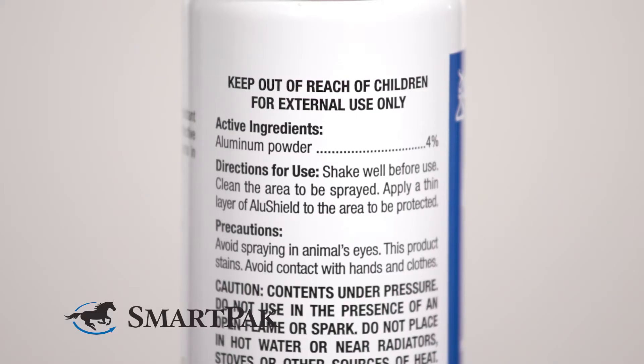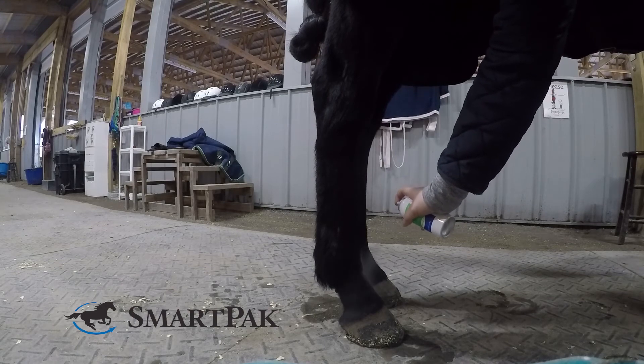The active ingredient in this is aluminum powder, and one of my favorite things is that you can apply it over any other ointment or treatment. To use, you're simply going to spray the affected area until it's lightly covered, and that's it. This formula is water resistant but it can also be removed with soap and water.